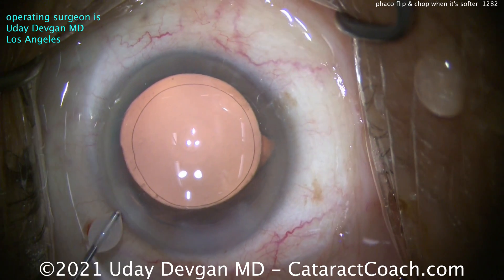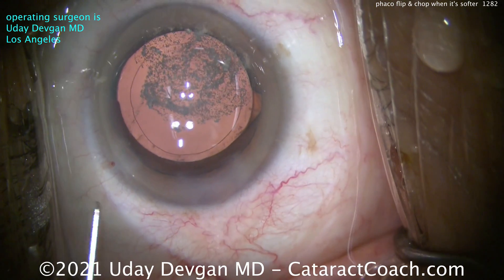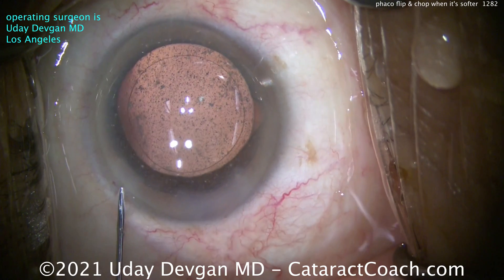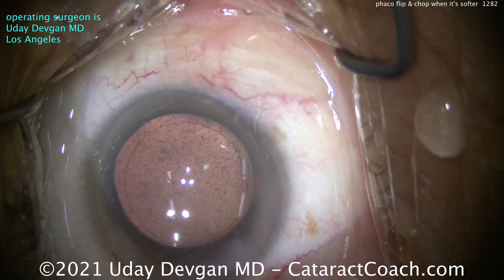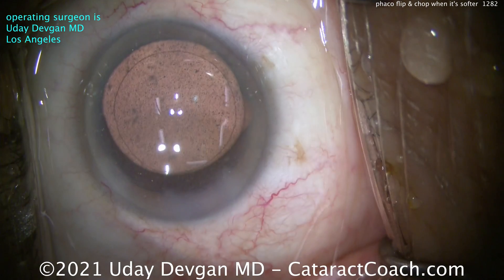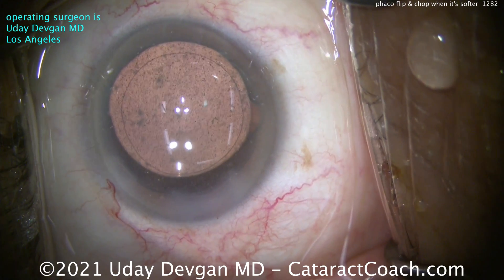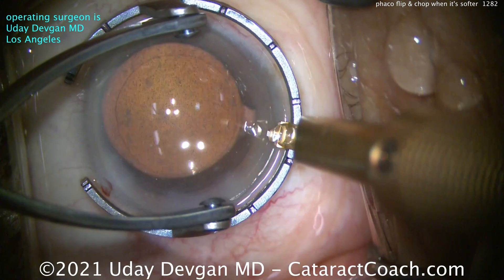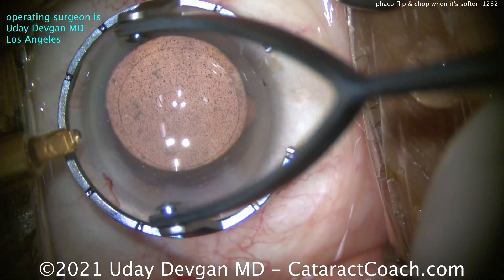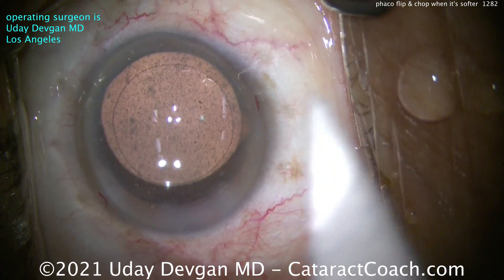At the end of the case, we'll put in some Triamcinolone — about half a milligram — to help quell post-op inflammation. It doesn't stay in the eye too long, just a couple of days, then washed out completely. That gives a good bolus of steroid so the eye should be absolutely quiet on post-op day one. A little tetracaine on a Wexel sponge to help seal the incision — you know about that osmosis effect of the hypotonic tetracaine. Now a very small LRI, only about half a diopter's worth — maybe even less. We'll do the other side too, just to help offset the effect of our incision. Checking everything to make sure it's all sealed up.